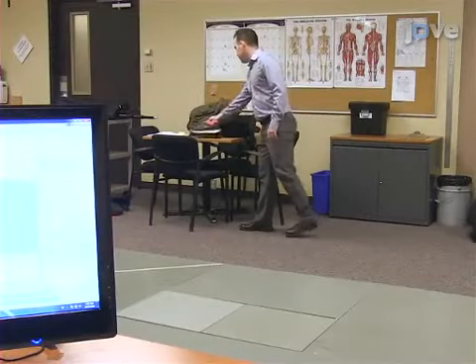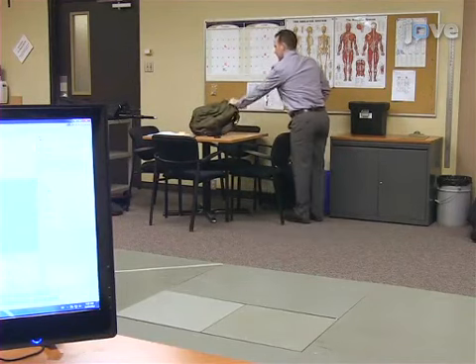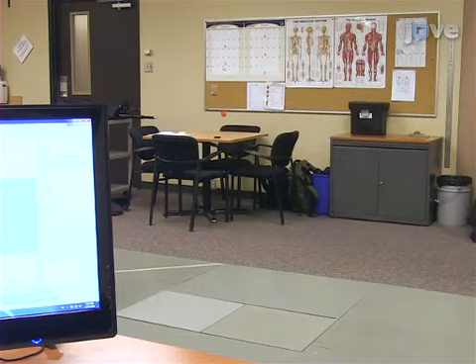To begin system preparation for this protocol, first clear the capture volume of any reflective material that may be observed by the cameras. This decreases the chances of actual skin-based markers being confused with stationary background markers during testing, and improves the overall accuracy of the session.